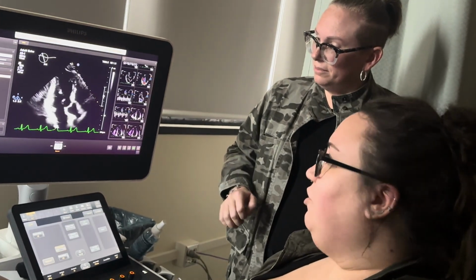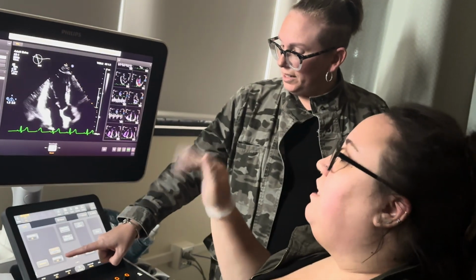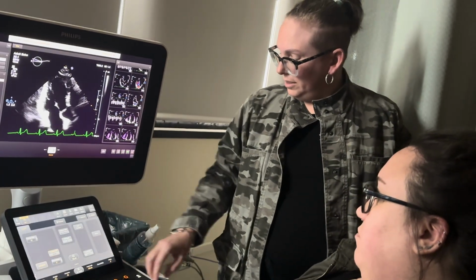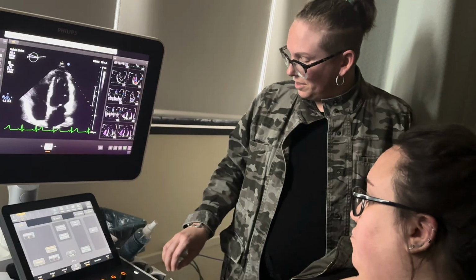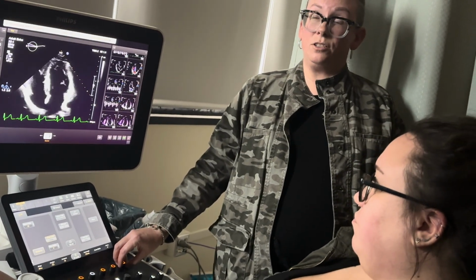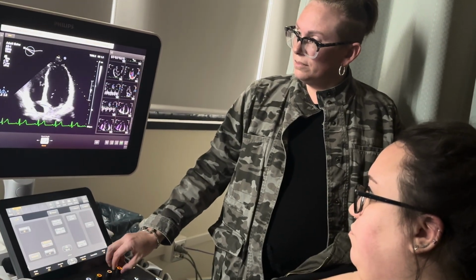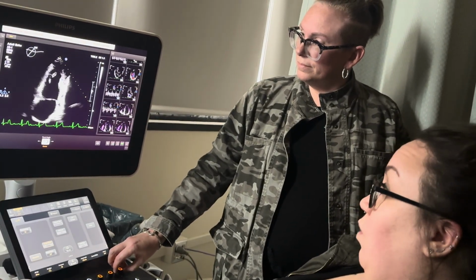There's 3 chamber. Look at that. Wow. I didn't move. I angled up. Okay, now I'm going to use your angle. Okay, so here, watch this. I rotate. Say it is off axis. Say that 2 chamber when you did this looks weird. You can turn it.